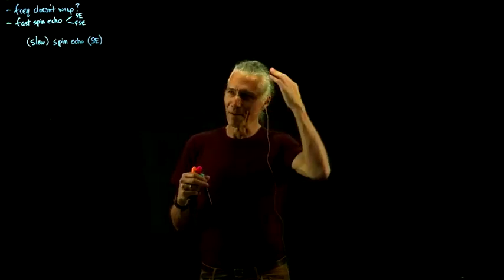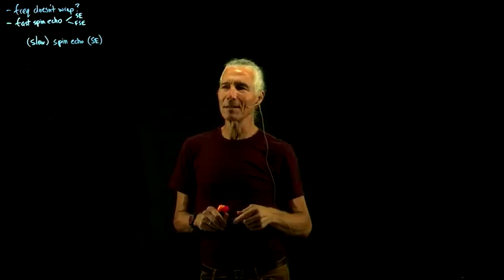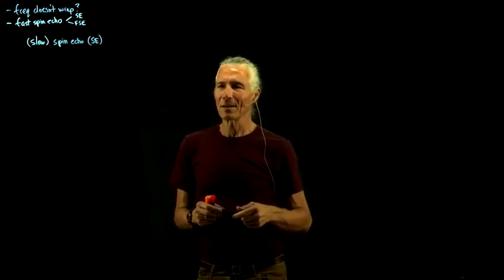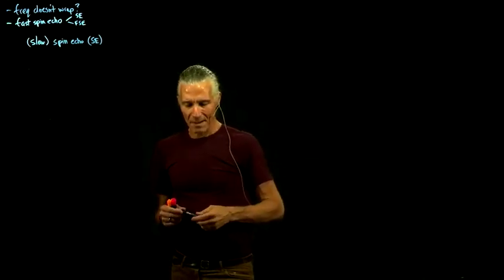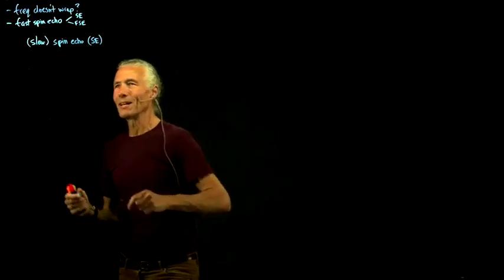So you'd sit in there 45 minutes, and obviously if you're taking 45 minutes, there could be a lot of movement occurring in that time, and so we need faster spin echo.